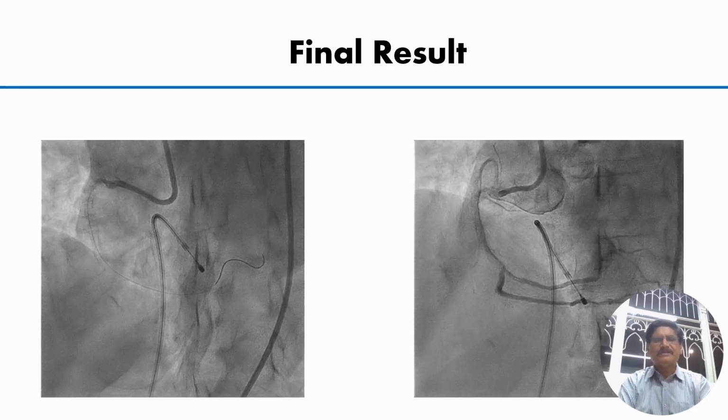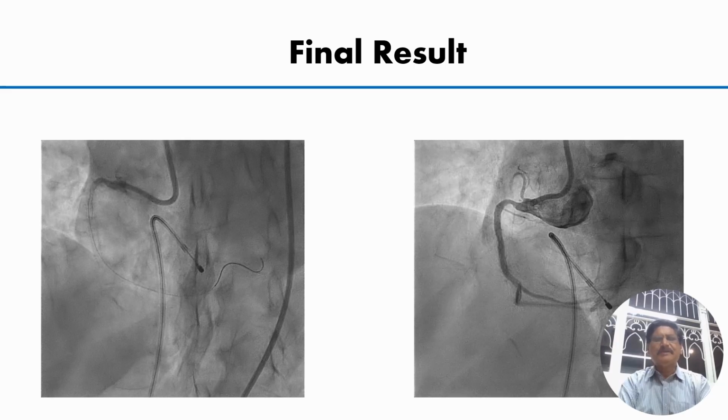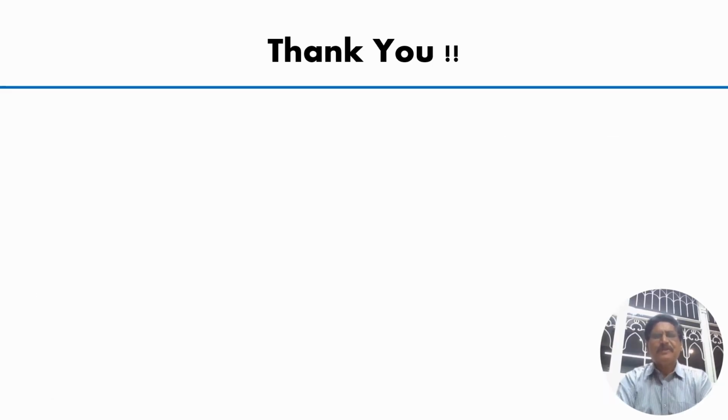So the important message I want to convey is that in a calcific lesion, unless you have good lesion preparation by an atherectomy device like the RotaPro, which is a user-friendly, handy device with warning signals, we can prepare the lesion followed by stent deployment, and optimizing with intravascular imaging like IVUS made the job easy in calcific lesions, with good short as well as long-term outcomes. Thank you.